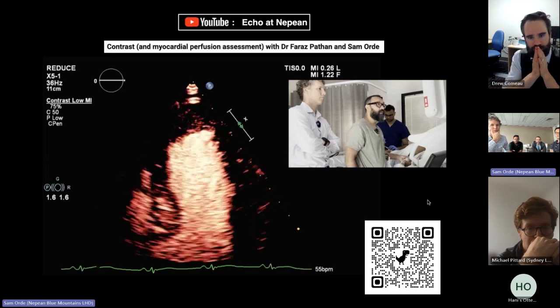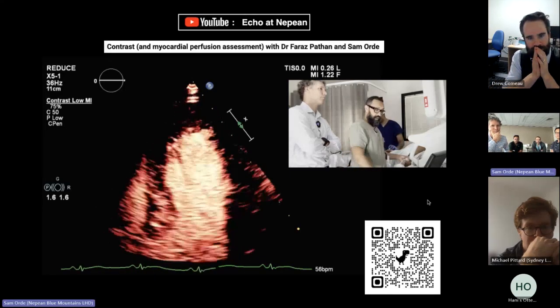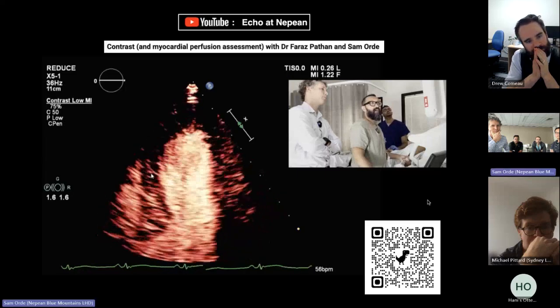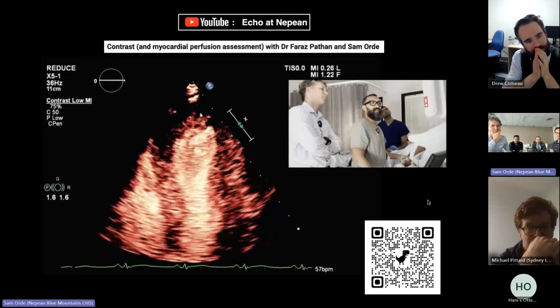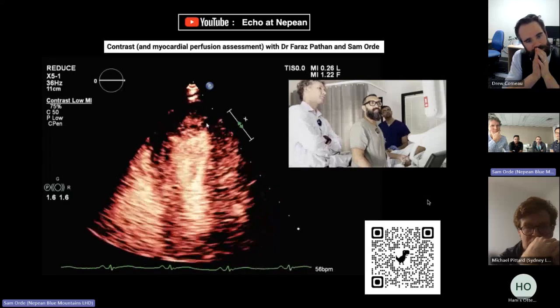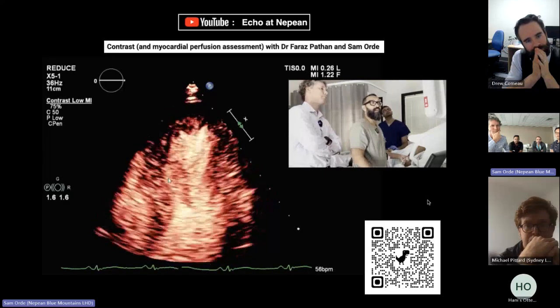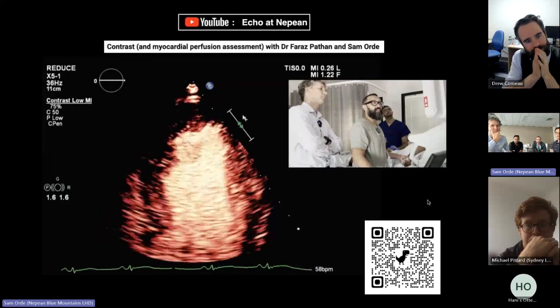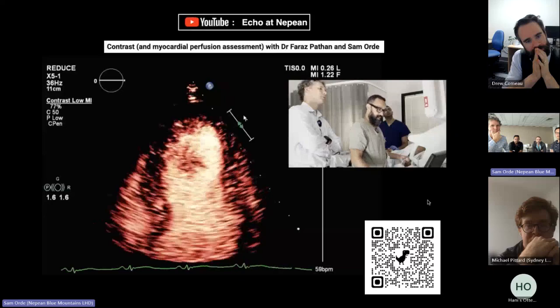And you're coming through. Here we go. Now you can clearly see the bubbles within the myocardium. What you see is that there's a paucity of bubbles around this region. Yeah, absolutely, and that is the area of microvascular obstruction. This is a thrombus, but because the sequence is optimized for myocardium, we're not getting as clear images of the cavity itself.